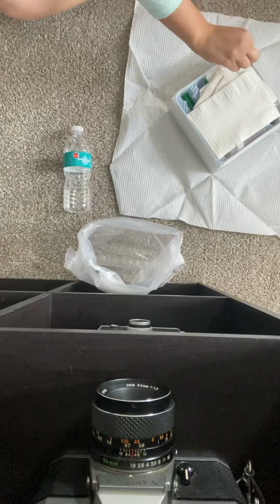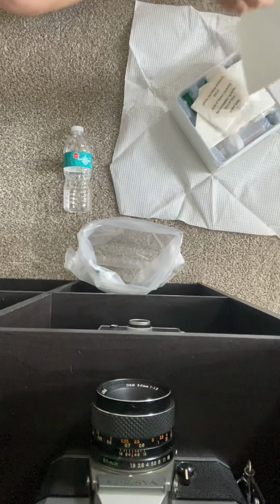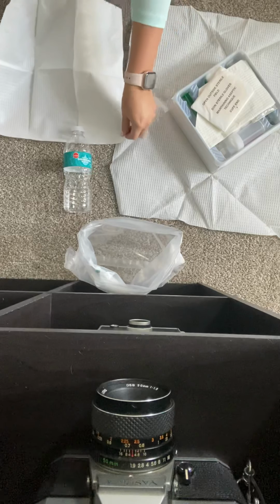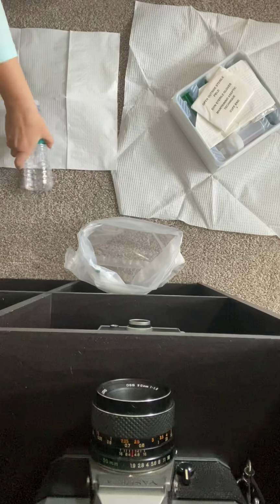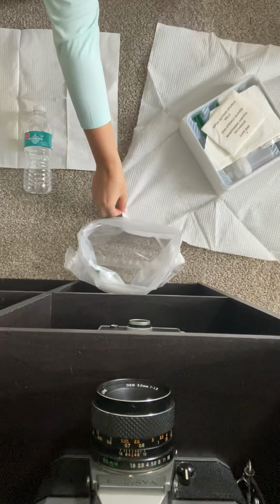So then I'm going to pull out this drape. Sorry, I don't know what that noise was. Again, I'm going to be mindful of this 1-inch border here. And then I'm just going to drape this under my patient. So this is going to go right under my patient. Sorry, I want to make sure that you can still see it. Okay. And I'm going to scoot this over just a little bit.